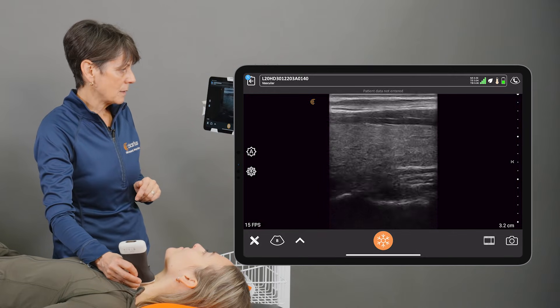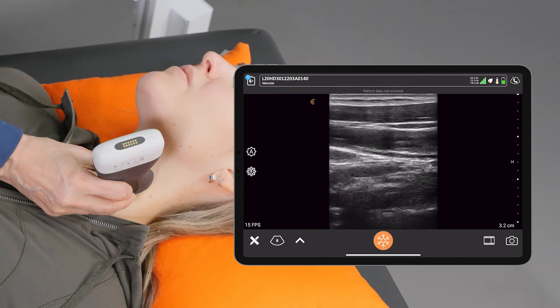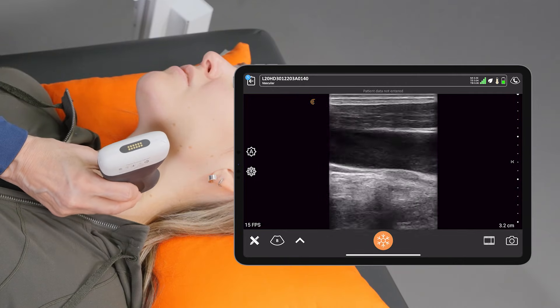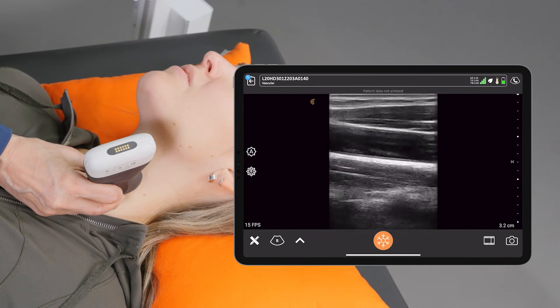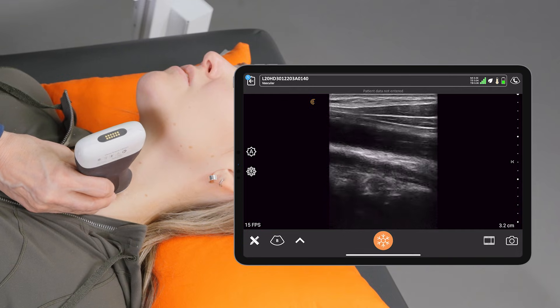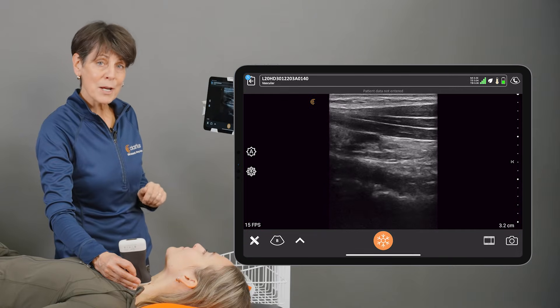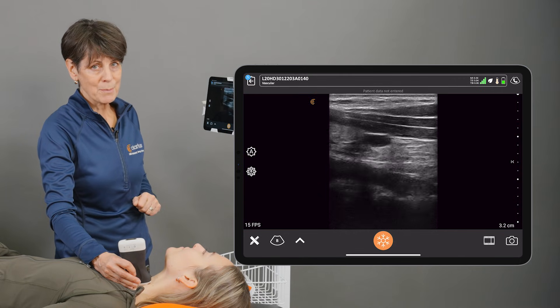If I am looking at that vessel lengthwise and I slide the scanner up, you want to try to maintain the vessel on the image, and then sliding down just gives you a different perspective along the length of that vessel. Practice makes perfect — try those maneuvers and they'll be really helpful when you're trying to optimize your image.